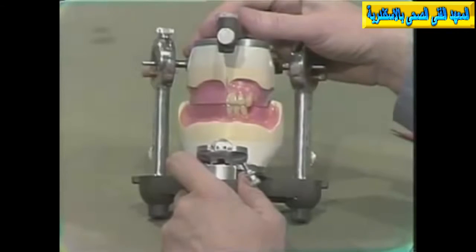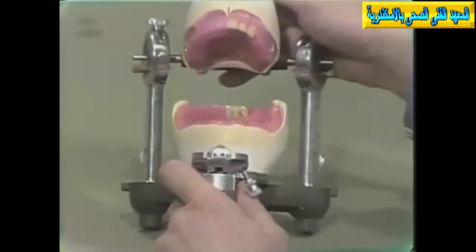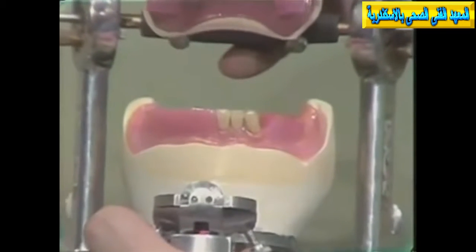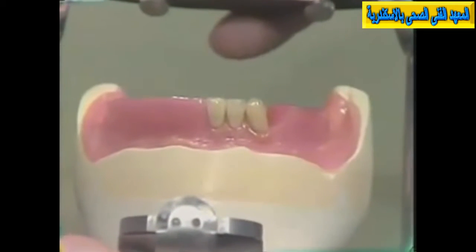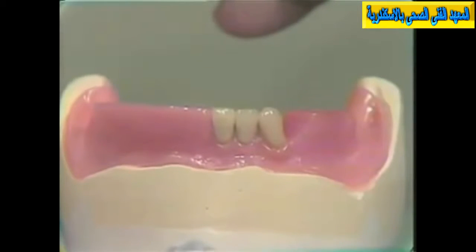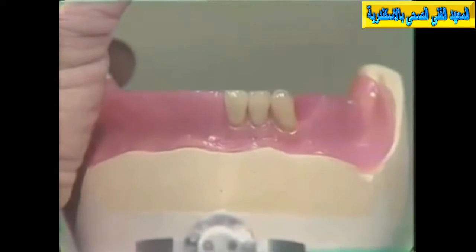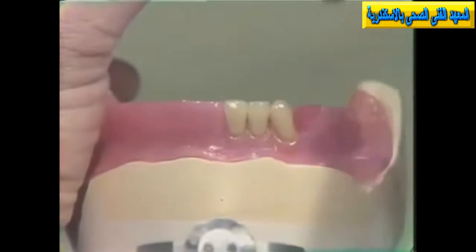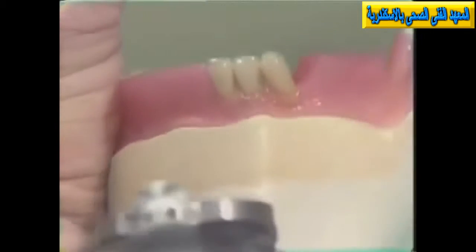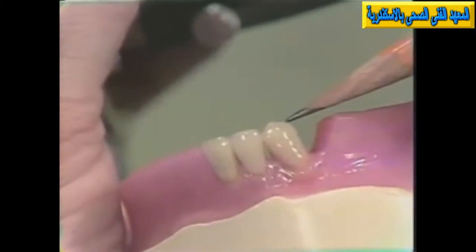The mandibular lateral incisor and cuspid are now set. Notice that the lateral incisor is positioned with the incisal edge even with the central incisor. The labial surface of the tooth maintains the continuity of the mandibular occlusal rim, and the long axis of the tooth is such that the neck is slightly to the distal. The mandibular cuspid is set with the cusp tip slightly higher than the lateral and central incisor, with the neck prominent and tipped slightly to the distal.